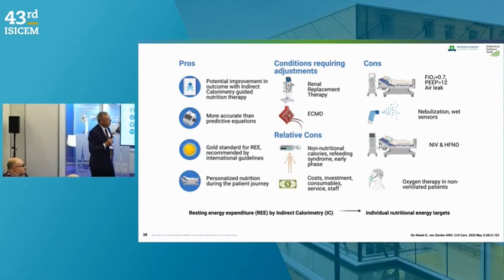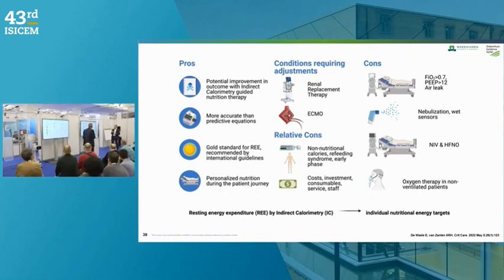The device is not working with the FiO2 over 80%. 80%, yeah. Most of the devices between 0.7, 0.8 you cannot use. So then maybe you should use the VCO2 only or an equation.